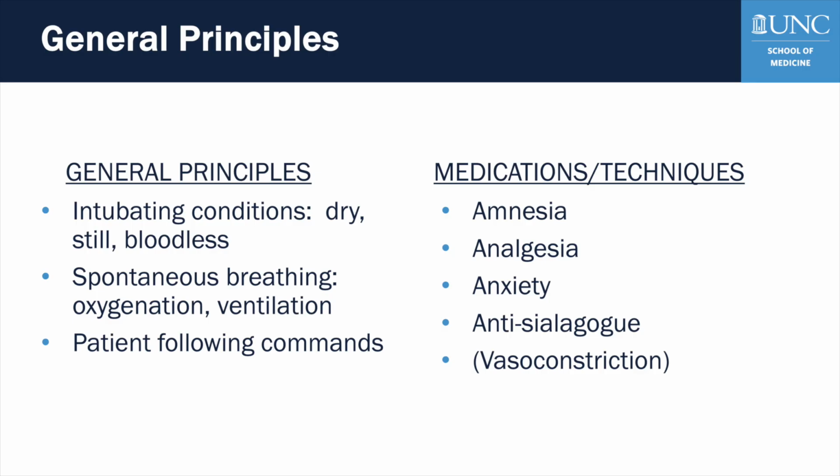For awake intubation, remember 3 general principles. Intubating conditions should be dry, still, and bloodless. The patient should remain spontaneously breathing to preserve oxygenation and ventilation. The patient should be following commands and cooperative. To achieve this, we can combine amnesia, so the patient has limited recall of the procedure, analgesia and topicalization to blunt the gag, cough, and pain, anxiolysis and antisialagogue to reduce anxiety and secretions, and finally vasoconstriction when using the nasal route to limit bleeding and improve visibility.